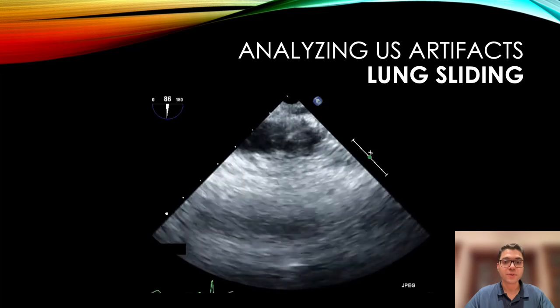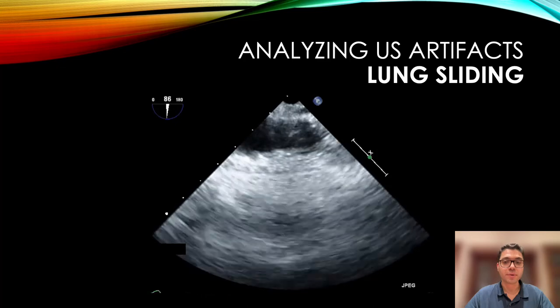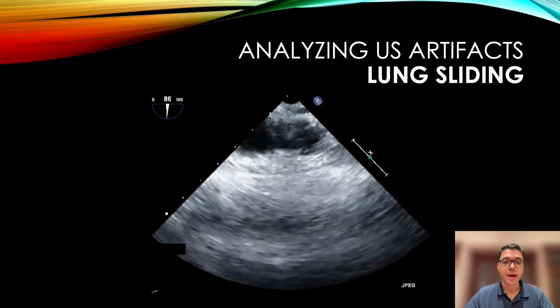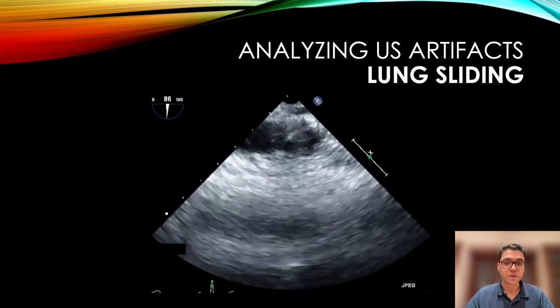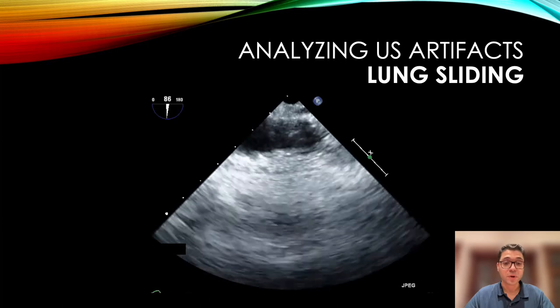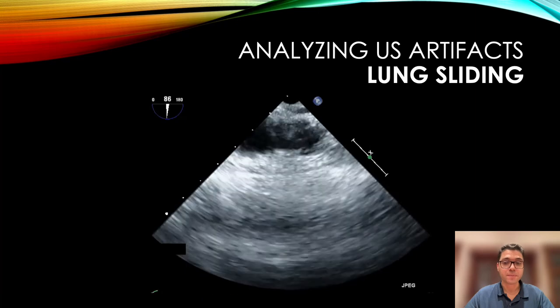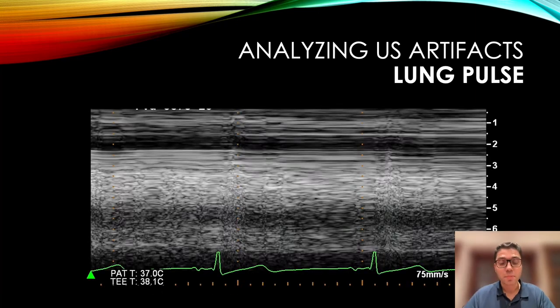Now let's discuss lung sliding. This is the normal sliding motion of the visceral and parietal pleura against each other with inflation and deflation of the lung. The absence of lung sliding is associated with the presence of a pneumothorax or could also signify selective contralateral intubation. Lung pulse is the normal rhythmic movement of the pleural line induced by pulsatile blood flow through the pulmonary vessels. Here we see this phenomenon in M-mode imaging. The absence of a lung pulse is associated with the presence of a pneumothorax.